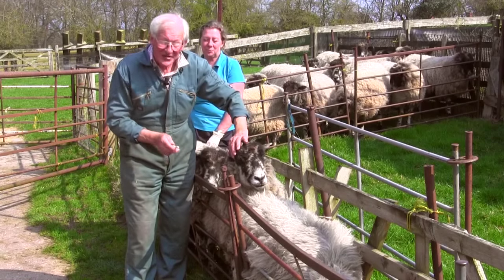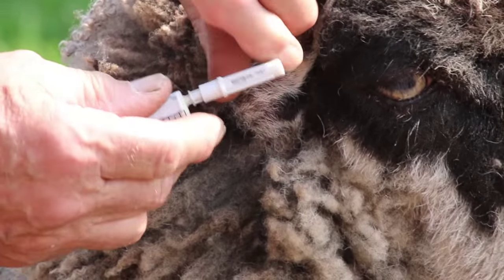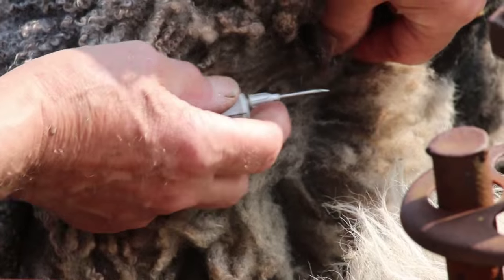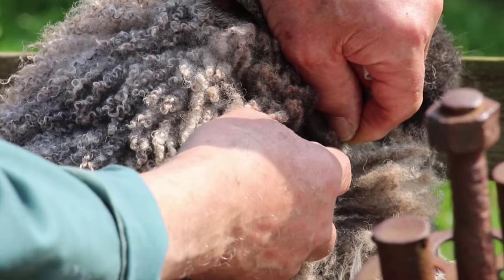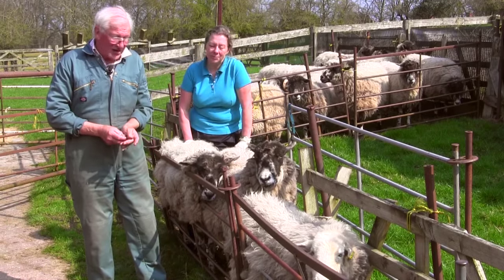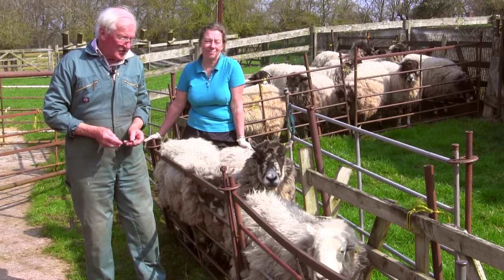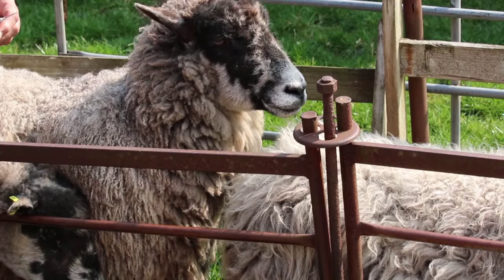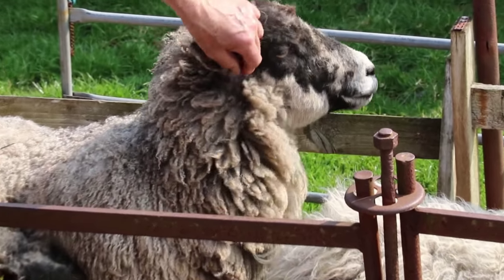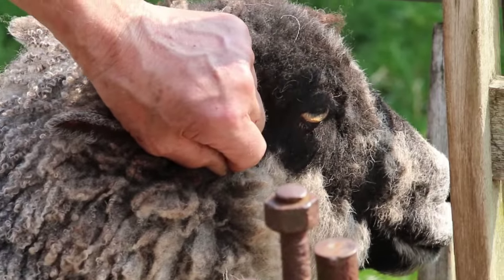There are two products which we have to inject at the base of the ear. This is not an easy technique. The base of the ear is just there — you tent the skin as best you can and inject into there. It's a very difficult technique, and if you're racing through 500 or 1000 sheep it's very difficult to do it correctly. From experience, too many people are injecting other than at the base of the ear, which causes problems with resistance and withdrawal times. The reason this site is used is that it is a part of the sheep not used in the human food chain.